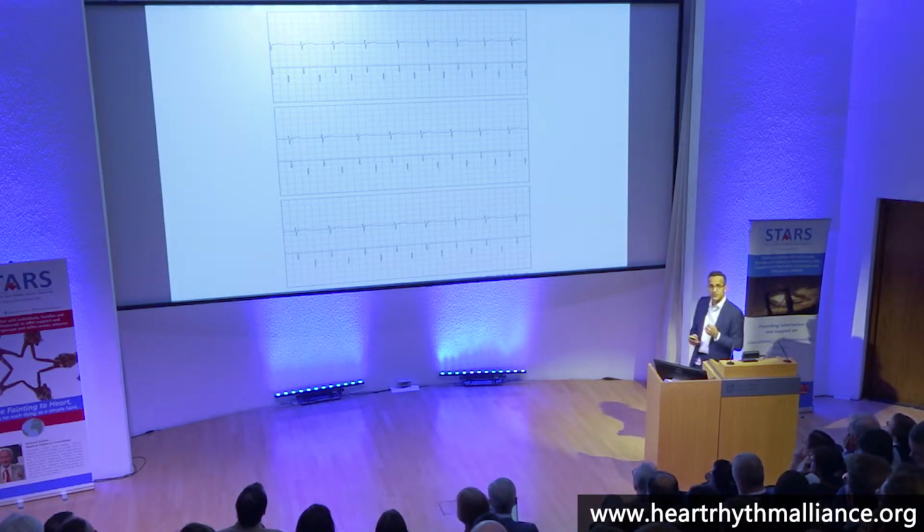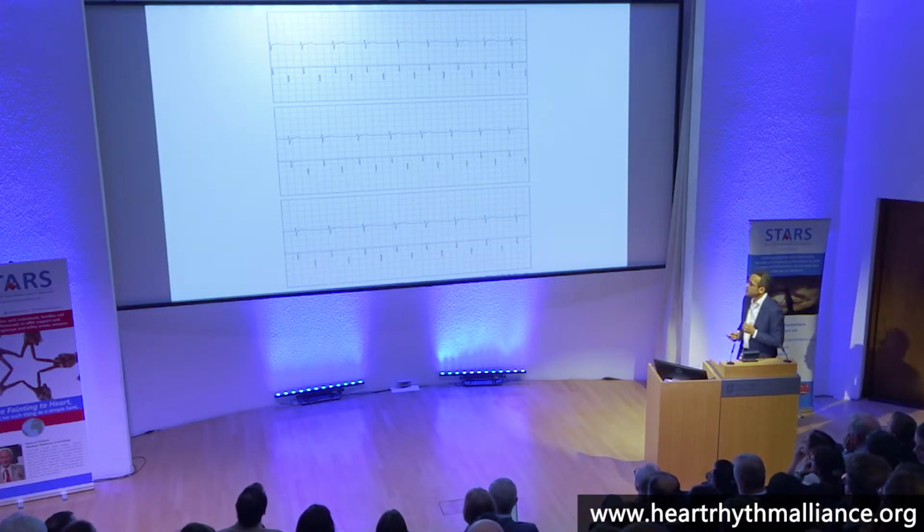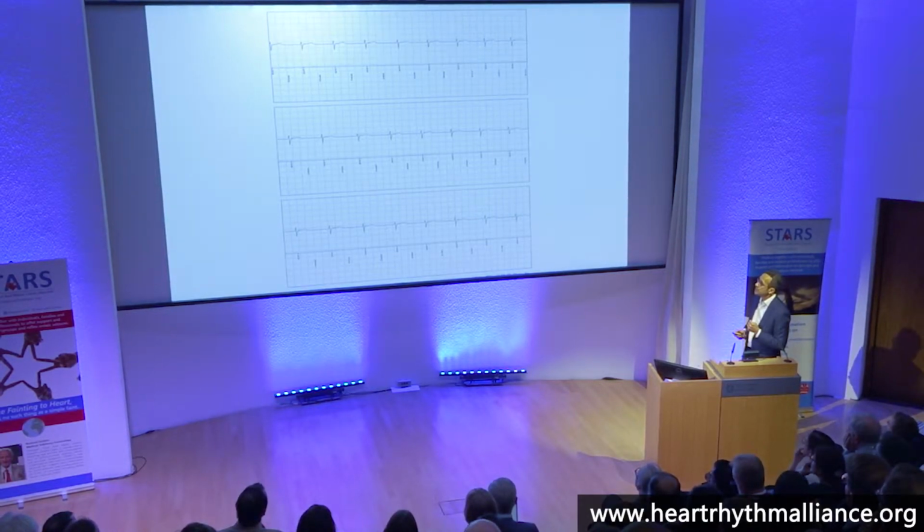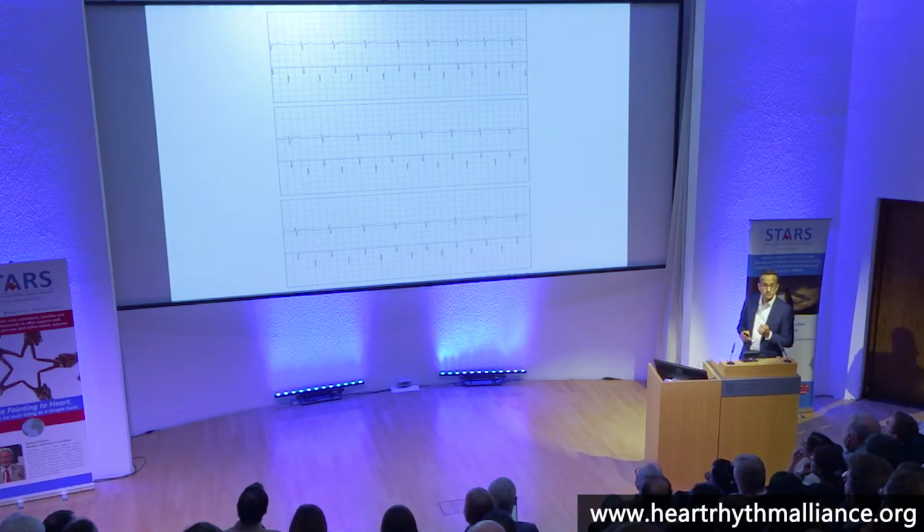I'm sorry if you've seen this before. This is an oldie but a goodie. This is one of my patients from quite some time ago. This is a disclosure from a loop recorder. You can see a PQRST there, yes? So that's the sort of resolution you'll get. This is a 66-year-old minicab driver who was syncopal during this event. Anyone pace him? Raise your hands if you would pace him.